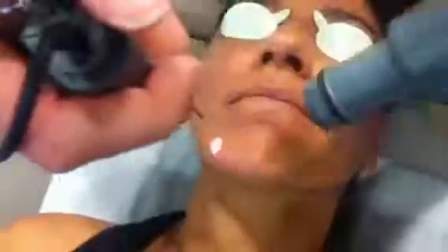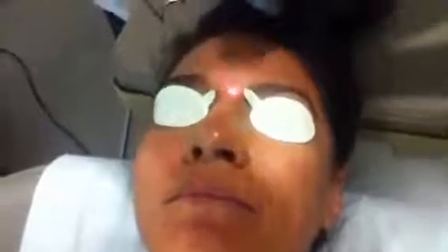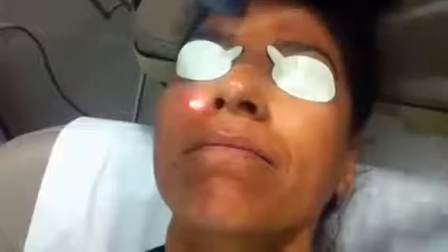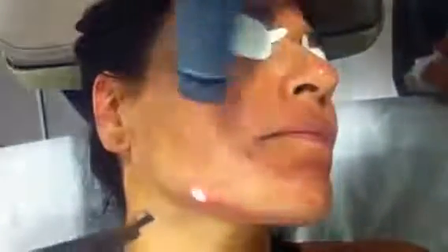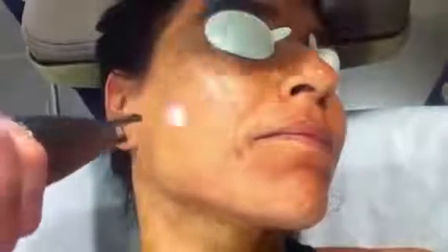My treatment endpoint as I'm treating the patient is just a little bit of pinkness on the skin. You don't want to over-irritate skin, especially skin that's had melasma — if you over-excite those little skin pigment cells, that's when you get pigmentation occurring. So it's a gentle endpoint that we use. With Spectra, I typically see patients for a series of treatments — we do 12 treatments. It's a little more frequent than other laser technologies. Most laser technologies, we usually see patients about once a month, but since we're gently and subtly taking away pigment over time with the Spectra, we usually see patients weekly over that course of 12. Then I start maintenance treatment, which is typically about once every four weeks, although it varies from patient to patient.